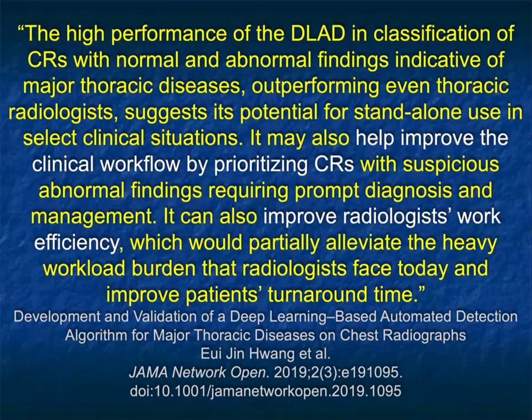And I think when you think about that, there are many places in the world where there aren't radiologists or enough radiologists, or many clinics where there aren't enough radiologists. So again, this may be helpful in that regard. Also, with limited resources, it may be used as a way of improving clinical workflow by prioritizing which x-rays have abnormal findings and which ones can be considered normal. It can also improve radiologists' work efficiency, which would partially alleviate the heavy workload that radiologists face today and improve patients' turnaround time. What more can you ask for? Regardless of the scenario you're speaking about, it can make improvements in that area.